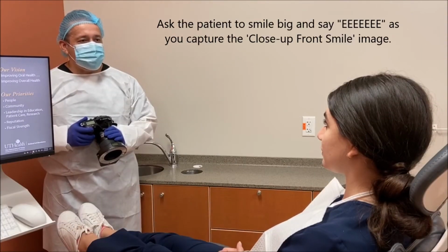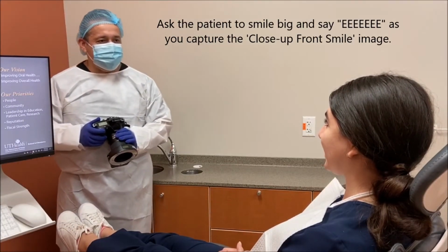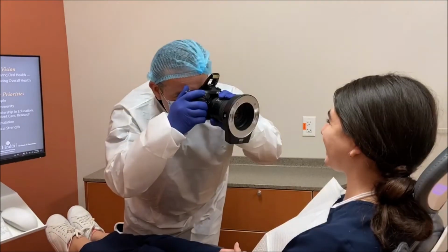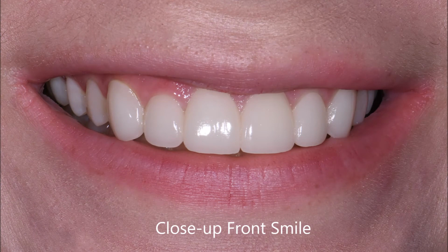Change the camera settings to MM, U2, lens magnification 1:3. Ask the patient to smile big and say E as you capture the close-up front smile image. Close-up front smile.